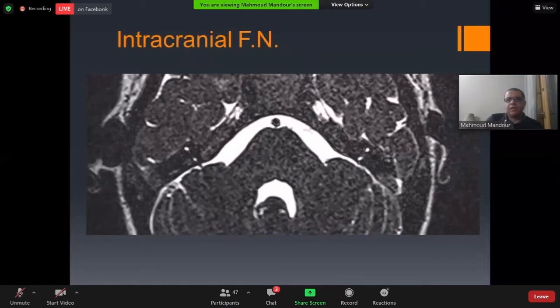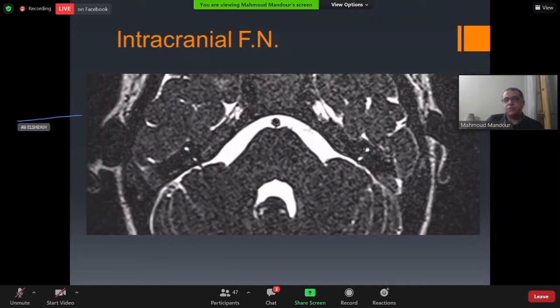For evaluation of the intracranial facial nerve, when we examine any MRI, I like to start with T2. T2 is the surgeon's friend — it's very good for anatomy and a very good starting point.